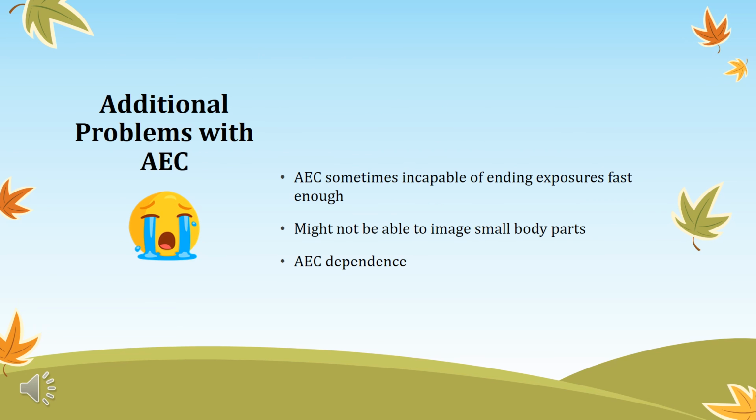Here are some additional problems with using AEC. AEC sometimes is incapable of ending exposures fast enough. It might not be able to image small body parts, and there's also AEC dependence.